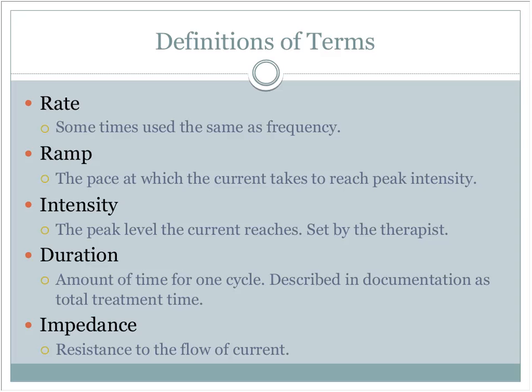The slower you build it up, sometimes the more comfortable for your patient, but you're losing that peak intensity time. So just something to be aware of. Intensity is the peak level. That's directly what is set by the therapist.